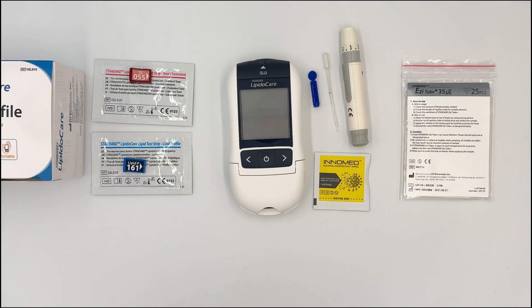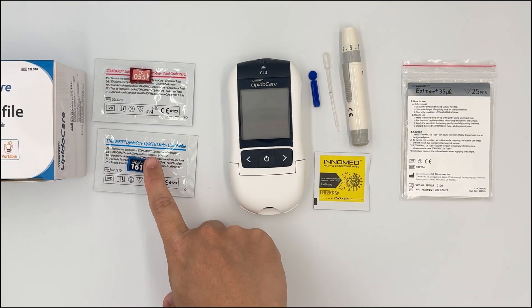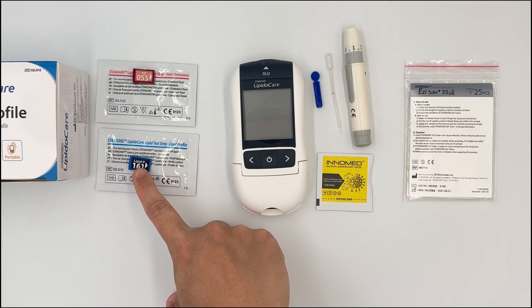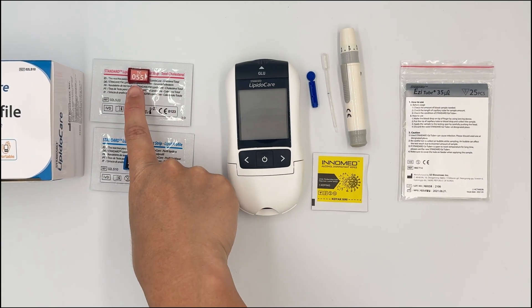The first thing to notice is that in your box you will have the strip and a code chip. If you buy the lipid test strip, you will have the blue strip with a blue code chip. If you buy the total cholesterol, you have a red strip with a red code chip.